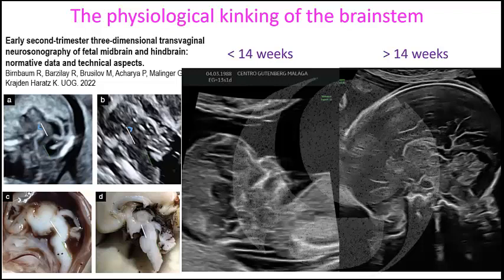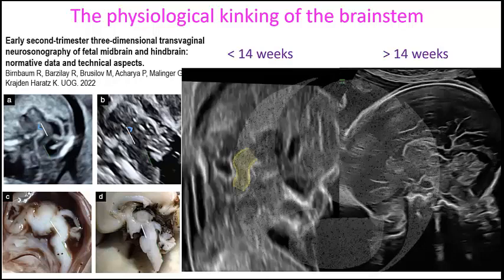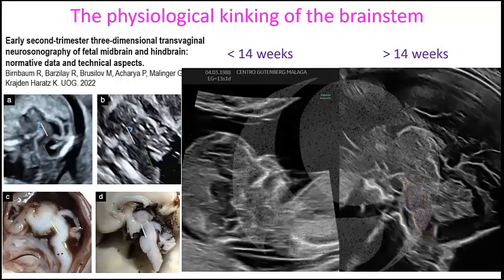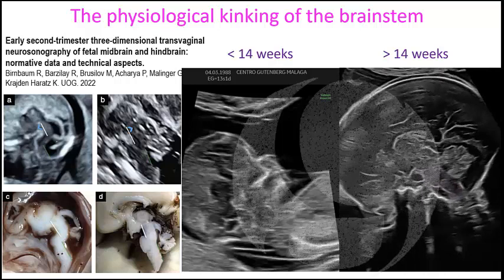In the neurosonographic assessment of the brainstem in the sagittal plane, we have to check its shape and alignment. We must be aware that in the first trimester the brainstem has a physiological C-shape or kinking that has to change to a straight shape beyond 14 weeks. Therefore, the persistence of a C-shaped kinked brainstem beyond 14 weeks should be considered pathologic and requires a complete neurosonographic assessment.